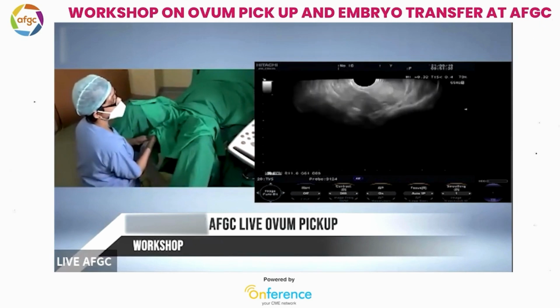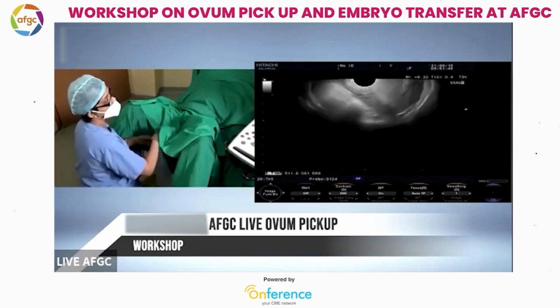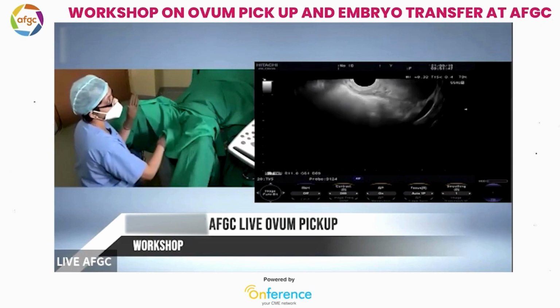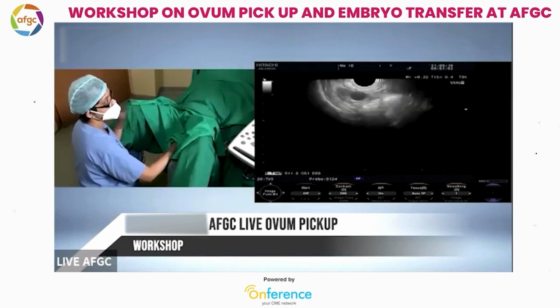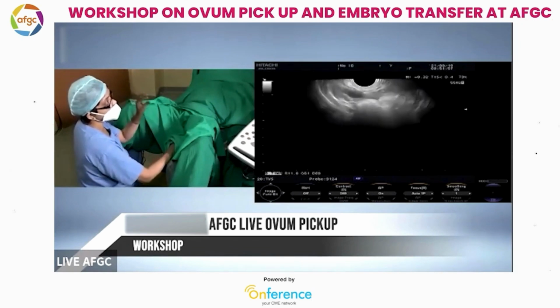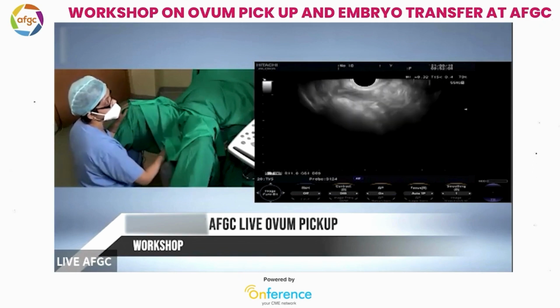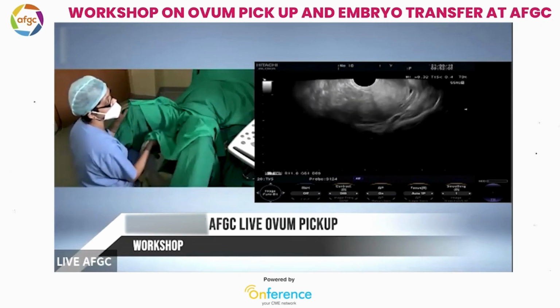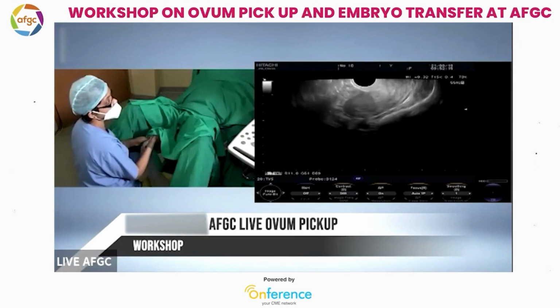I always zoom out to be able to see the peritoneum as well. If your view is too big, then you might lose certain adnexal features. So it's always good to zoom in and zoom out and make the uterus and ovaries a little small, so that the iliac region, any peritoneal adhesions, any hydrosalpinx, etc. can be seen. So again in this we see the endometrium does not look too good. We will measure in this plane. Can we freeze and measure?